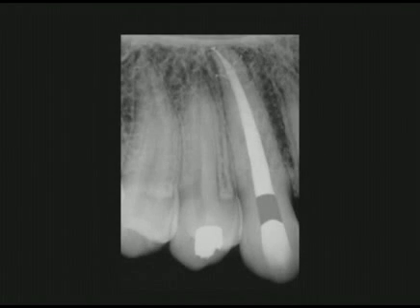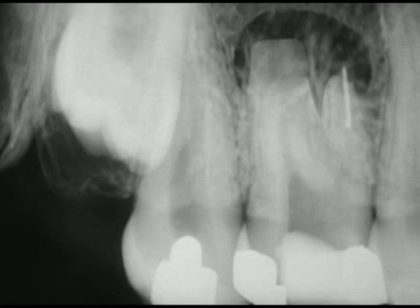And the postoperative film reminds us of the necessary retreatment steps. Note the densely packed system and the 3 apical portals of exit. Here's a challenging case, a distal oblique angled preoperative film of a previously endodontically treated and surgerized first molar.